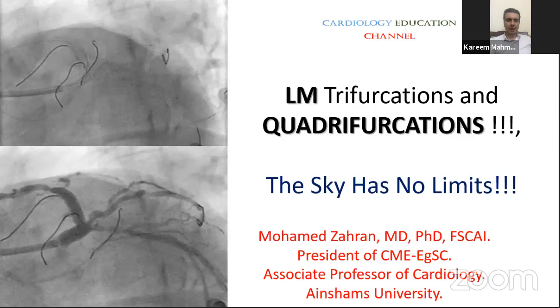Actually, left main trifurcation, it's almost always left main, represents a clinical and technical difficulty in interventional cardiology. Once you are faced with a case with a left main trifurcation, you should combine the clinical and technical data of the patient to reach the appropriate decision. And regarding revascularization, you must remember there is another choice rather than intervention, which is surgery. So first, if you are not confident with your procedure, or if you expect to face a very difficult technical procedure, you can always refer the patient to surgery, except for cases of acute and urgent situations with hemodynamic instability.